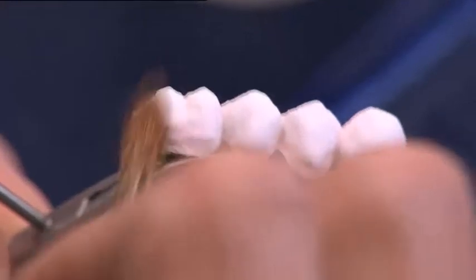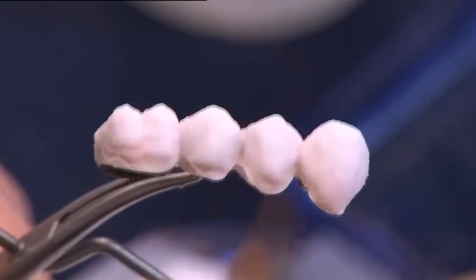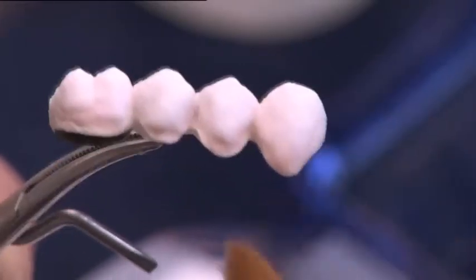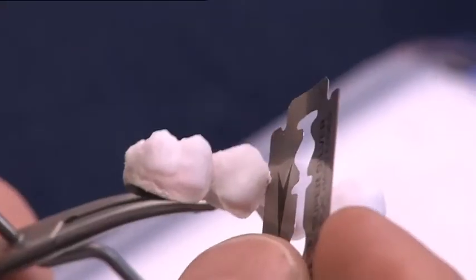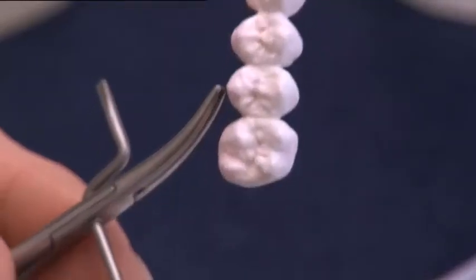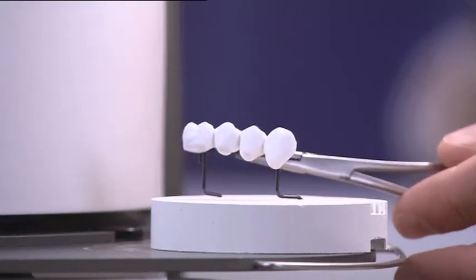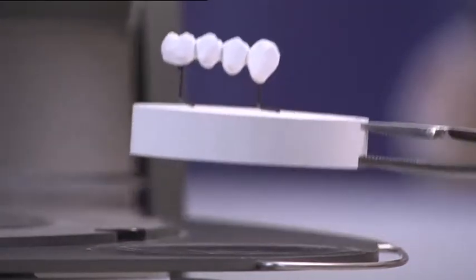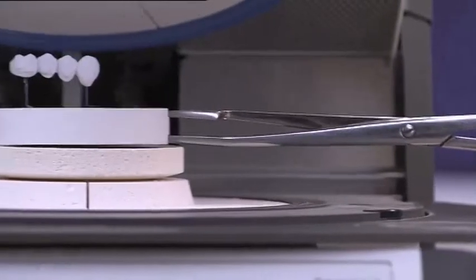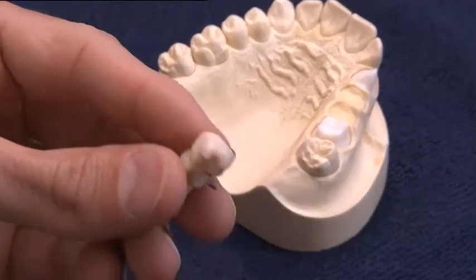The ceramic surface is densified by running a large dry brush over it, which will reduce a retraction of the ceramic in the cervical margin. The layered bridge is separated in the interdental areas using a sharp instrument in order to control the volume shrinkage of the ceramic. Subsequently, the first dentin incisal firing is conducted according to the respective firing parameters.